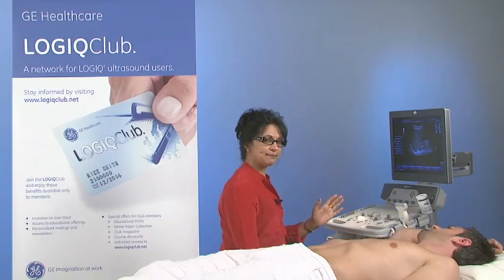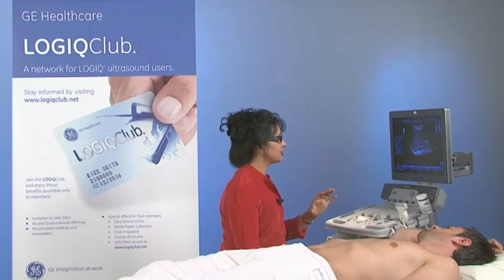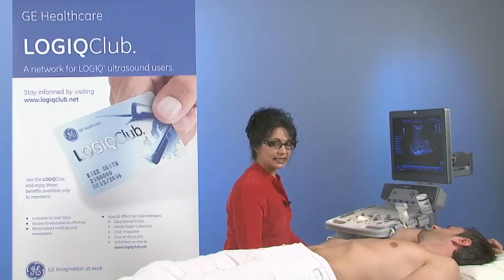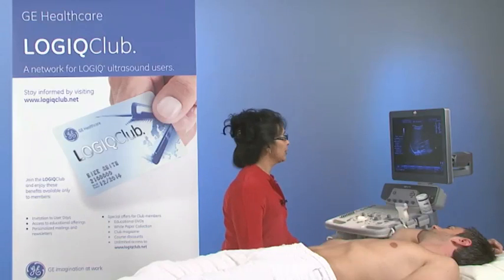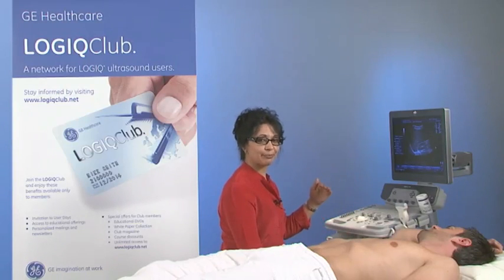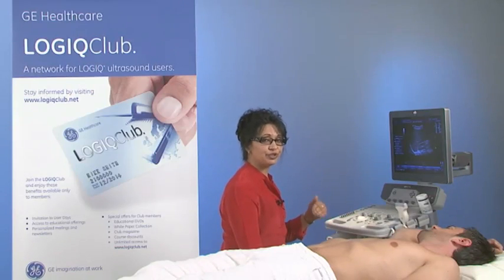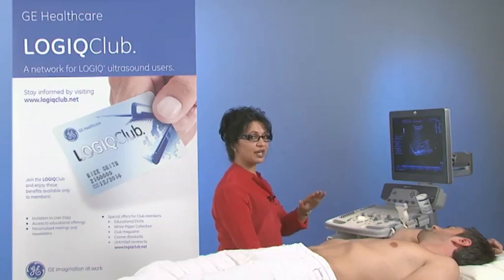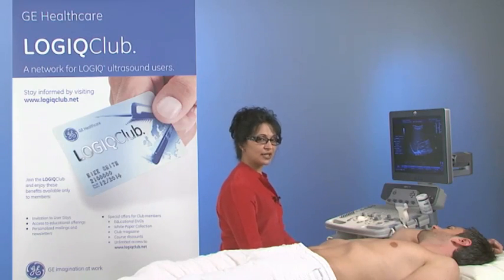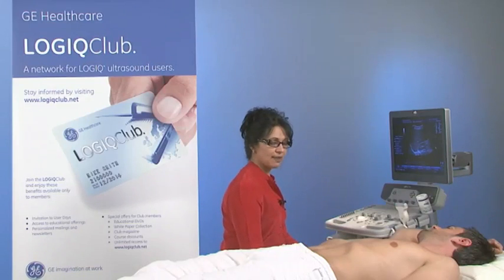If your image is very noisy and you want to smooth it out, reduce your gain. You can also reduce your dynamic range, and you can increase your frame average. And finally, if you have a patient that is technically difficult on the bigger side, where noise is a major factor in this, you would want to choose the correct probe, reduce your frequency so that you're actually getting better penetration, and also reduce your dynamic range because you want to actually get rid of those low-level echoes in the image. Okay, so that's your B mode optimization, and we'll do a little bit about color.